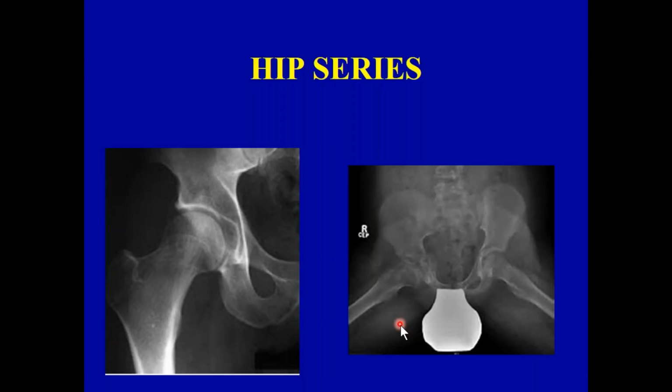If it's you and you're conscientious about your x-ray work and your work speaks for itself, and you burn a CD and the hip x-ray looks like this on the one side, that speaks volumes about your x-ray work and your office. So, the whole discussion about gonadal shielding. If you don't use gonadal shielding, the only tool available to you is collimation, and if you're not collimating at all, your patient is being exposed unnecessarily.